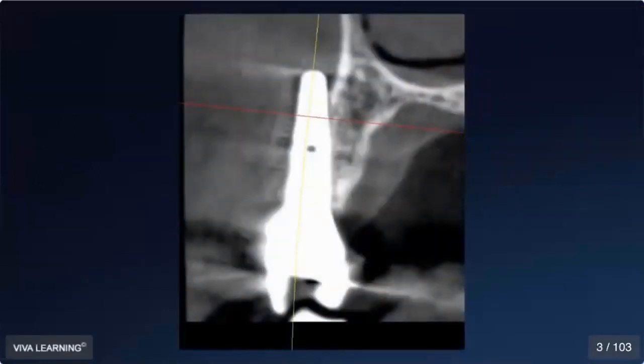I love starting some of my talks with images like these. We have an implant prosthodontist on faculty, and about once a week he sends us an image of a case that someone sends to him because they're just not quite sure how to restore or what to do with it. So this should be pretty obvious. It's a cross-section of a CT scan, restored implant, but the apex is obviously way outside the bony housing. This implant was placed, integrated, uncovered, and restored. Pretty amazing that stuff like that is out there.